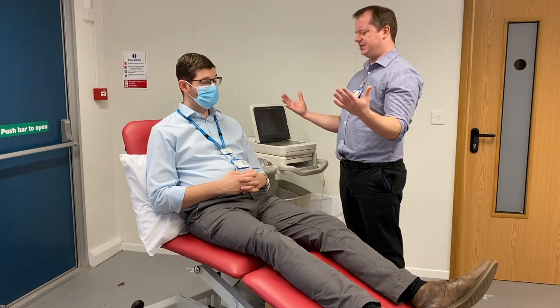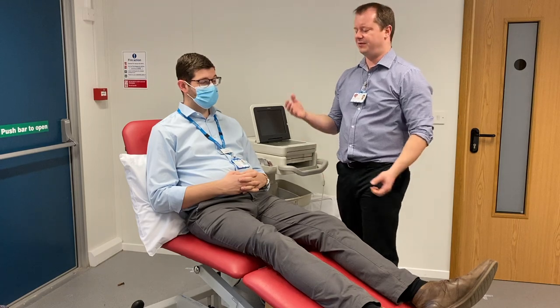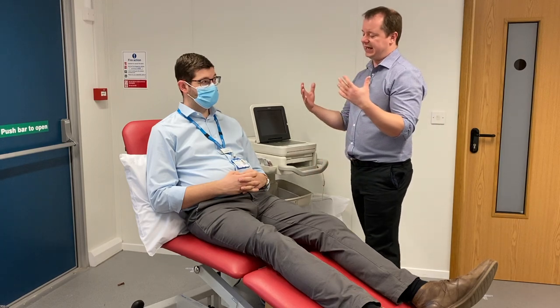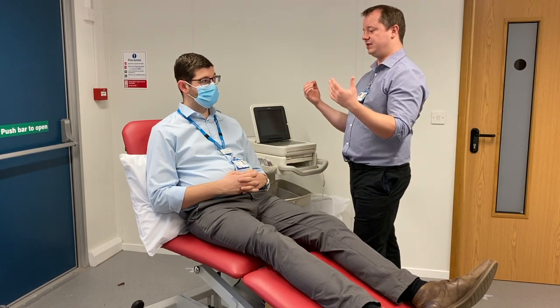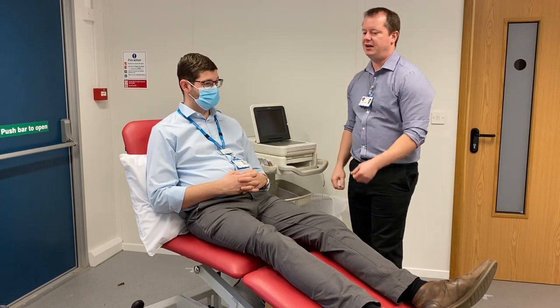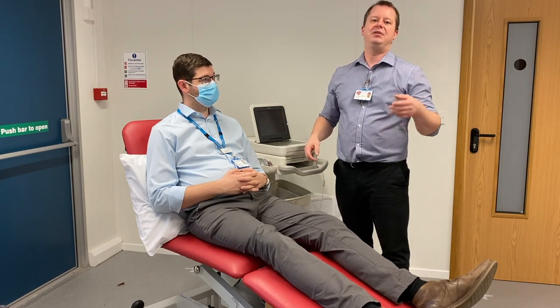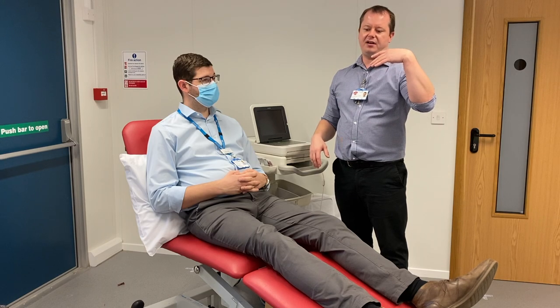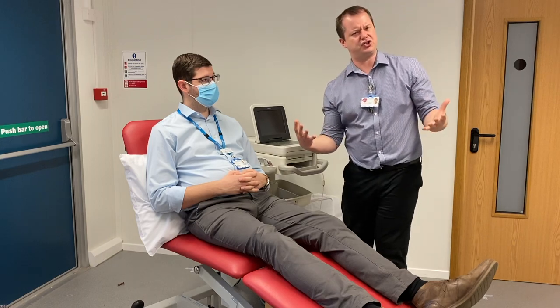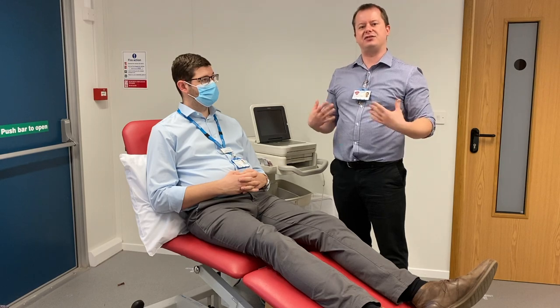The trouble is that some patients might not know what an ECG is, so you have to gain consent for something they actually understand. Also, part of this procedure is going to be looking at the patient's bare chest, so it's really important to get consent. You need to keep the explanation simple — say you're going to be recording the activity of their heart muscle and will need to stick some stickers to the left side of their bare chest. Mentioning the bare chest now means it won't come as a shock later.